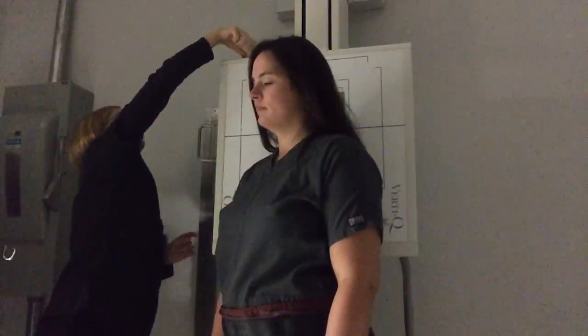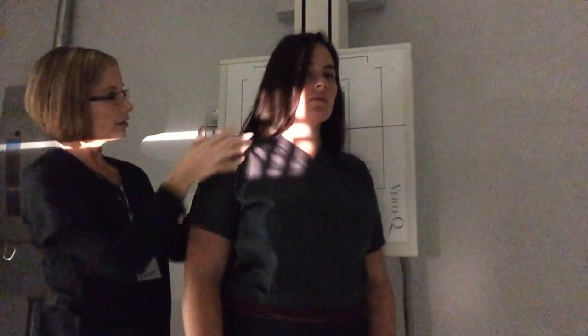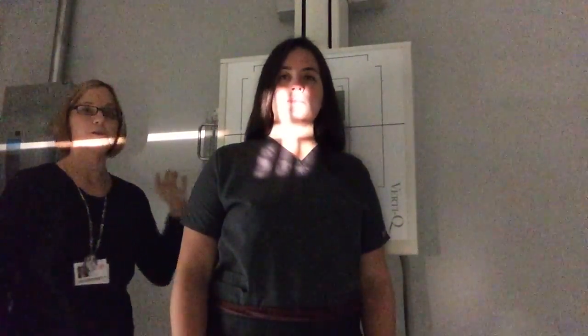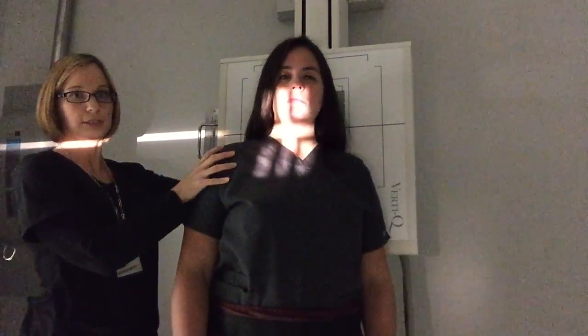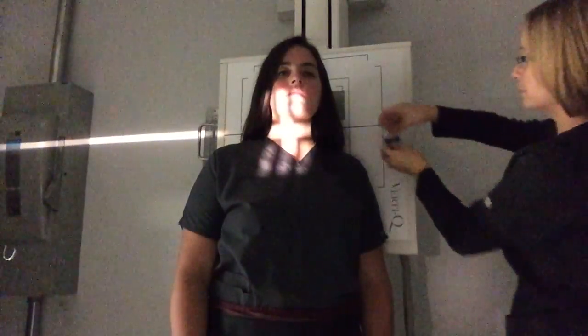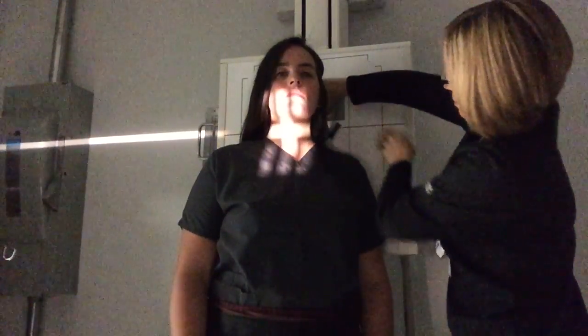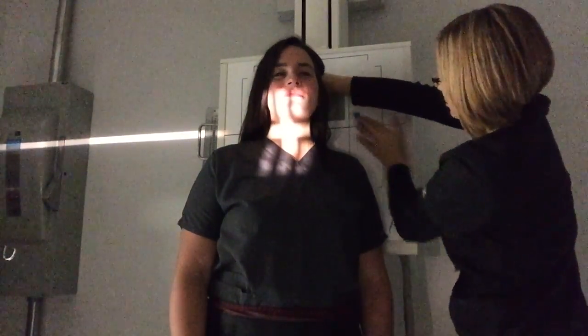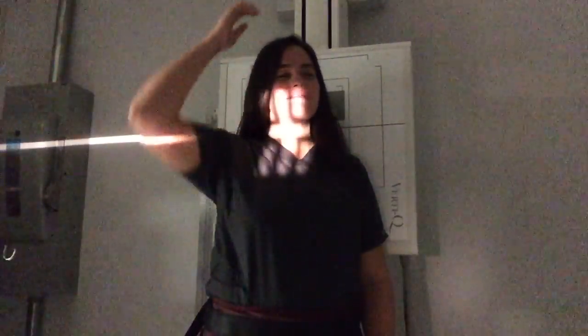The next one is exactly the same except we're going to turn the patient the other way to get the left one. We're going to center in the exact same place, still turning the patient at a 45 degree angle, still centering right on the Adam's apple at C4. Ask the patient to lift her chin up just a little so it's not in the way of the picture. Mark the left side since it's up against the IR, then expose at 85 kVp with the patient holding her breath.